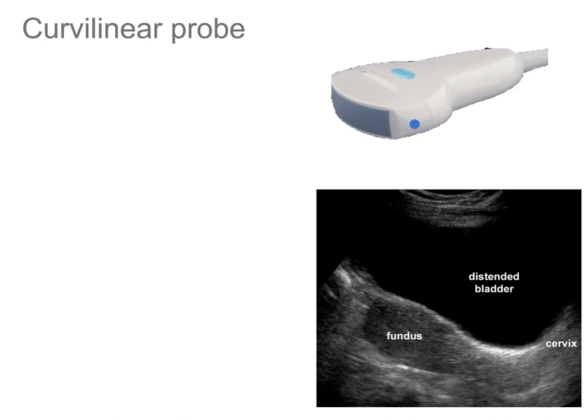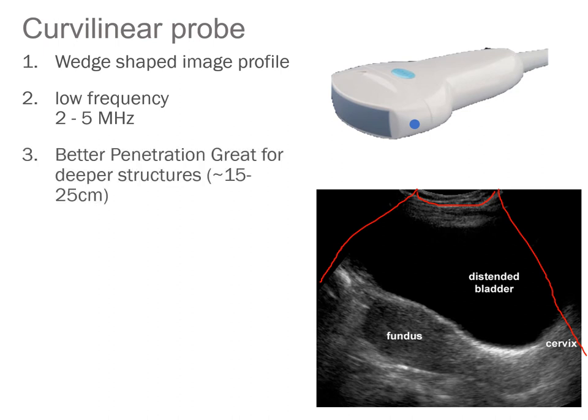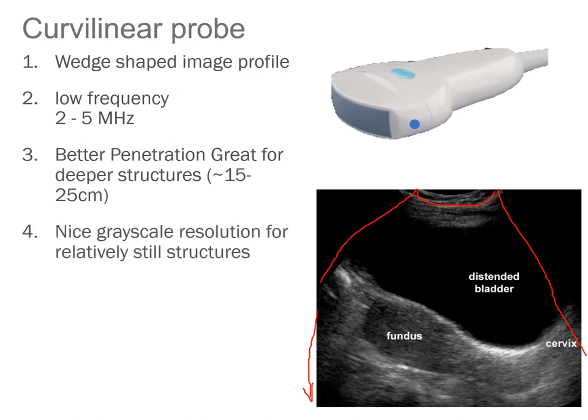Then we have a linear probe that's been bent, so it's called curvilinear. So it has a wedge-shaped image profile. Notice how it comes out like a wedge, almost like an ice cream cone with a bite out of the top. It's much lower frequency, 2 to 5 megahertz. Therefore, it's going to have a lot better penetration for seeing deeper structures. And this is a favorite for abdominal or pelvic ultrasound. But it's not going to have as good a resolution, especially in that bottom half or the far field of the image. It does provide some nice grayscale resolution for relatively still structures.